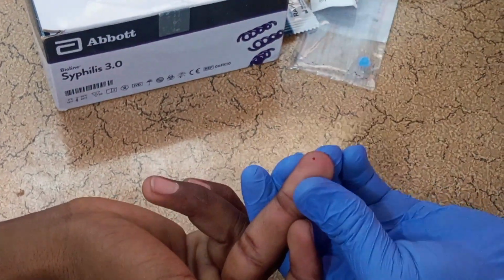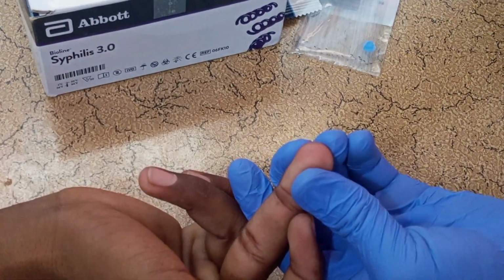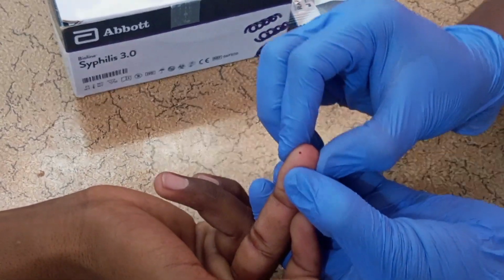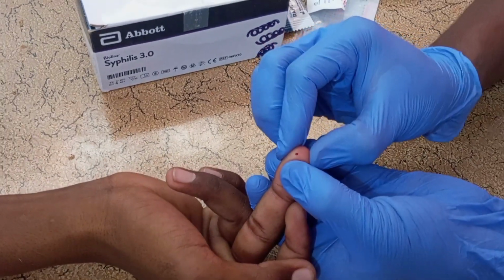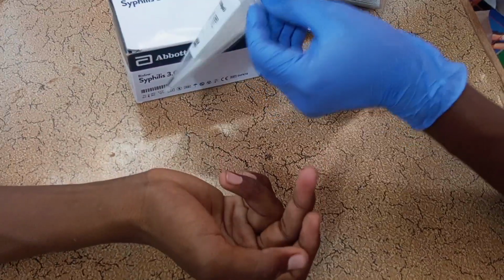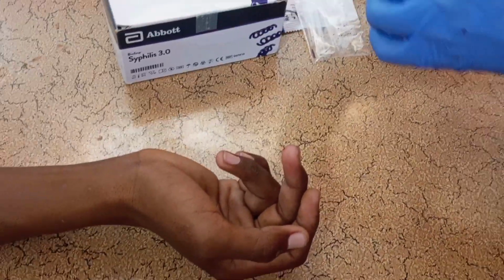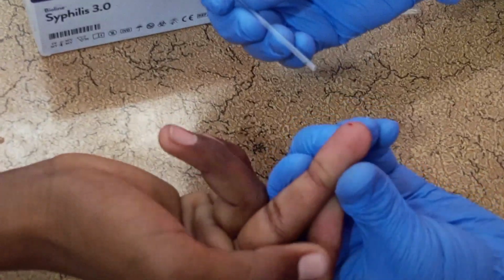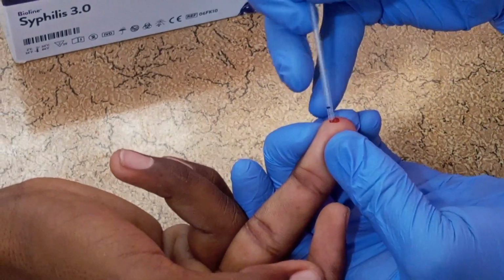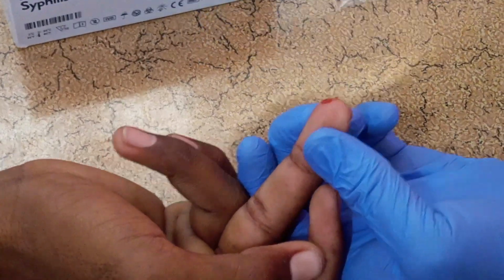You wipe off the first drop of blood. Then you squeeze the hand to get a sample, or drop, of blood. You get your blood dropper to collect the blood. You squeeze the hand gently like this, so you get the sample of blood.